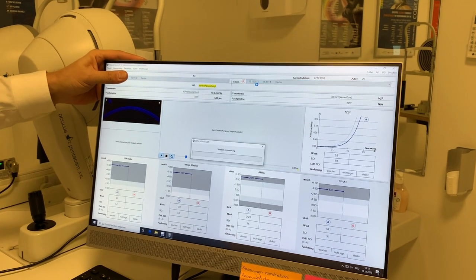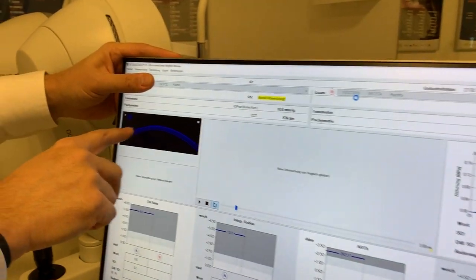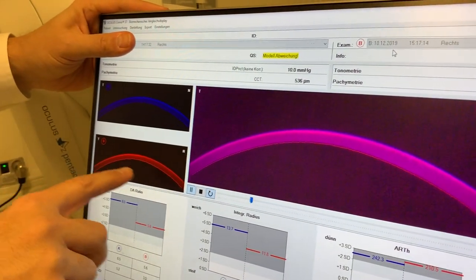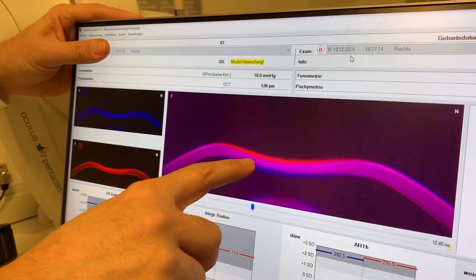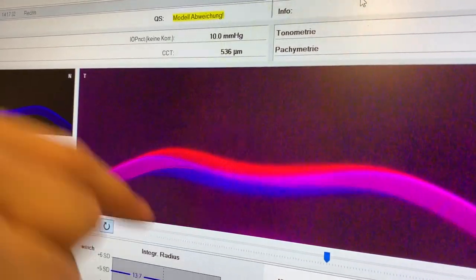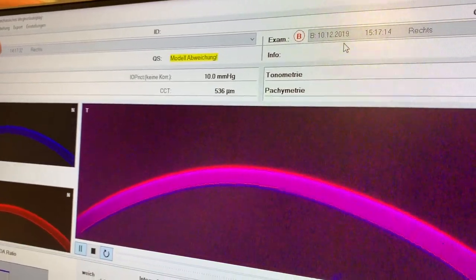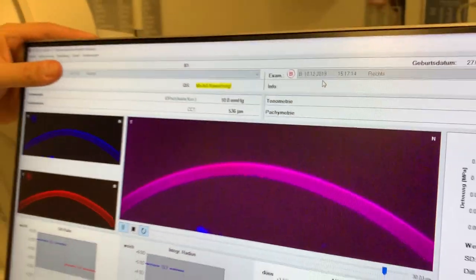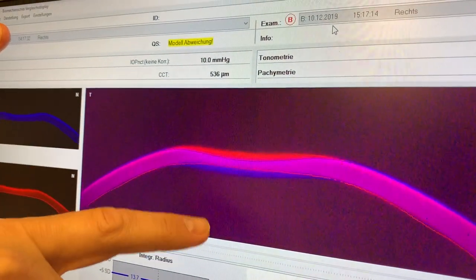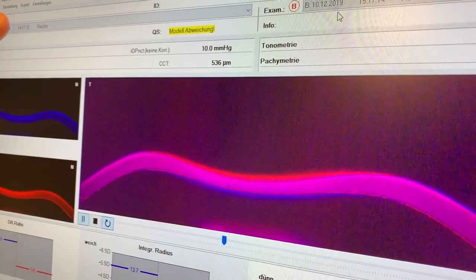This is quite amazing. The blue cornea is the cornea before crosslinking, and the red is the same cornea one year after crosslinking. The blue one deforms, goes further in, and the red one is stiffer — thus the deformation is not as strong. The red one stays on top, the blue one goes further in. You can even see it with your own eyes.